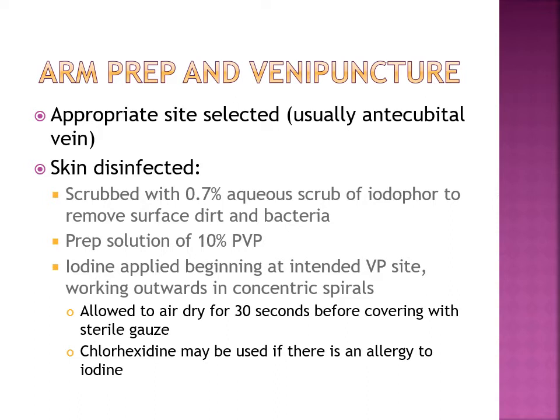With the automated processes of knowing how much blood needs to be donated in the bag and weighing it as it's going, they actually have a thing to punch in on a machine that will actually time this for them.